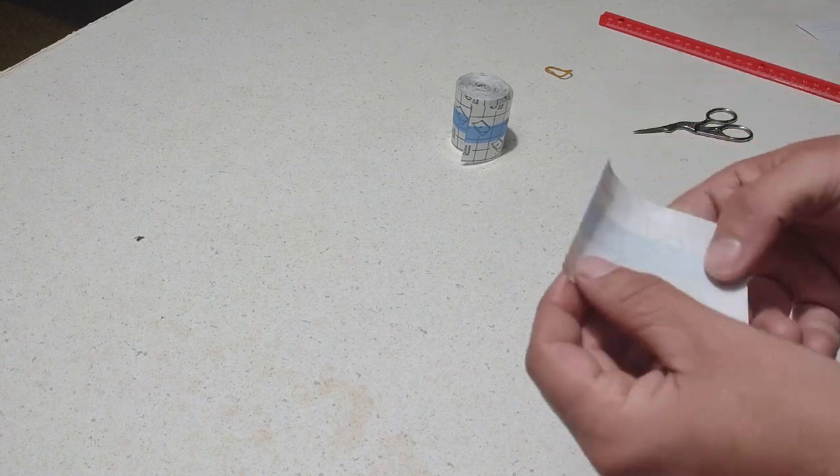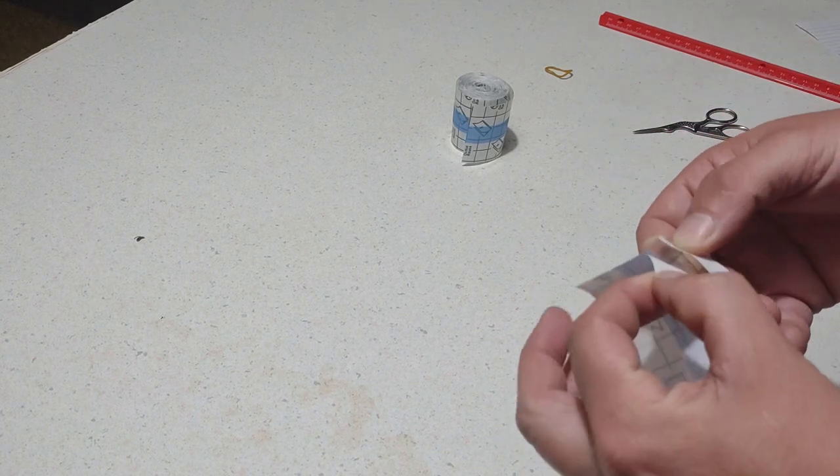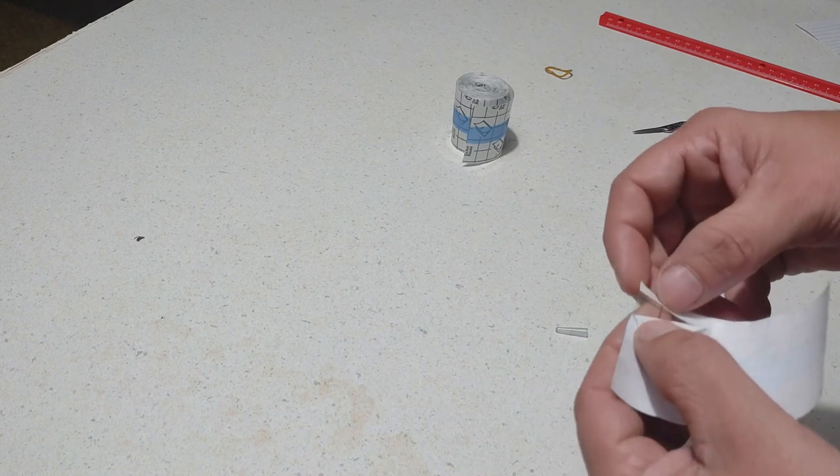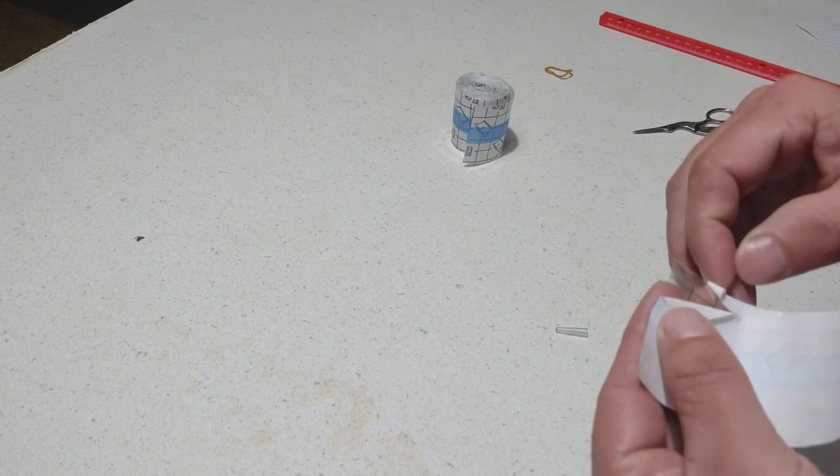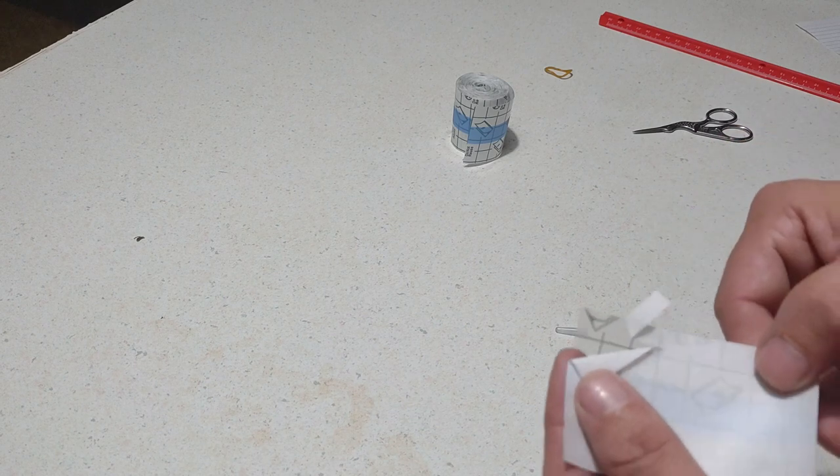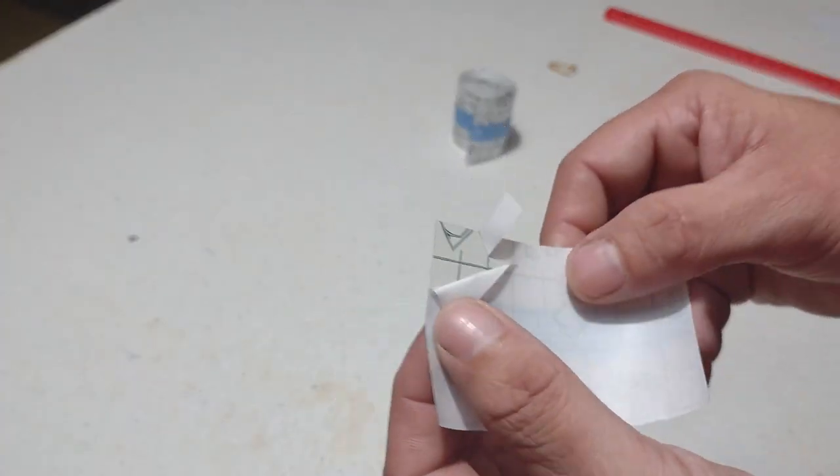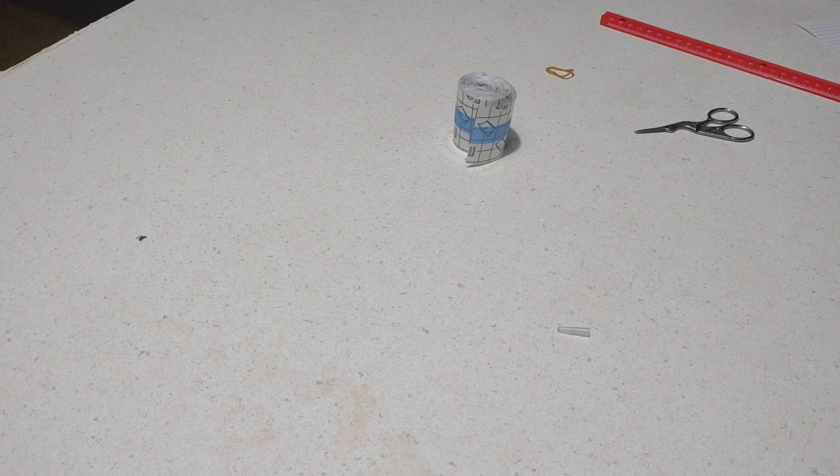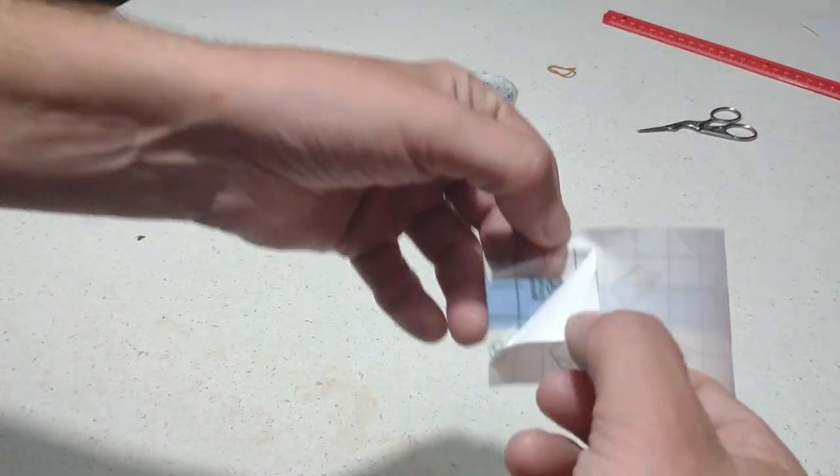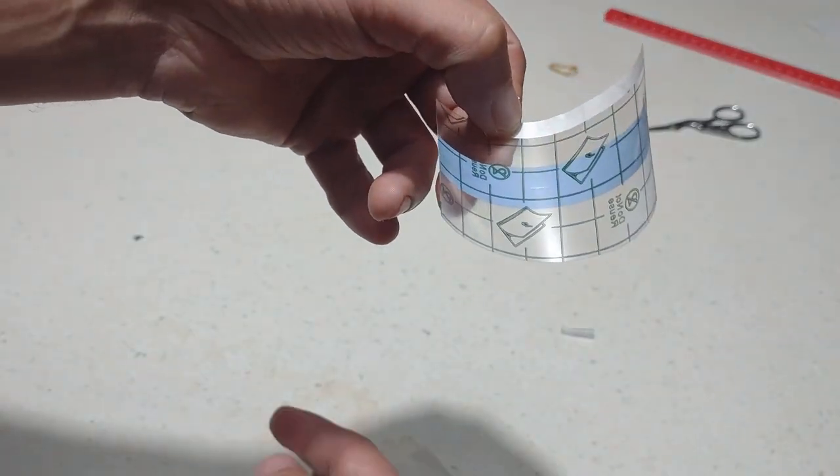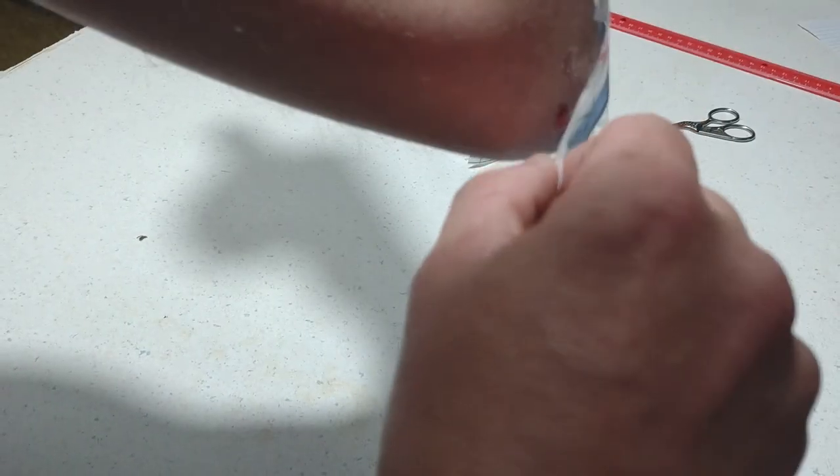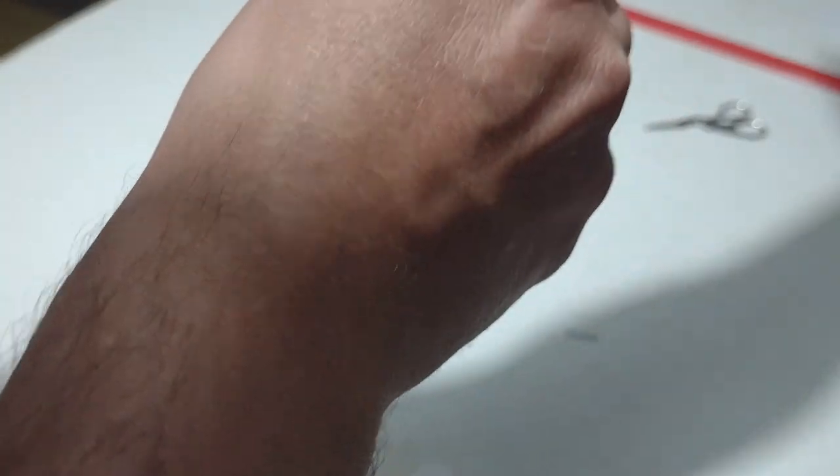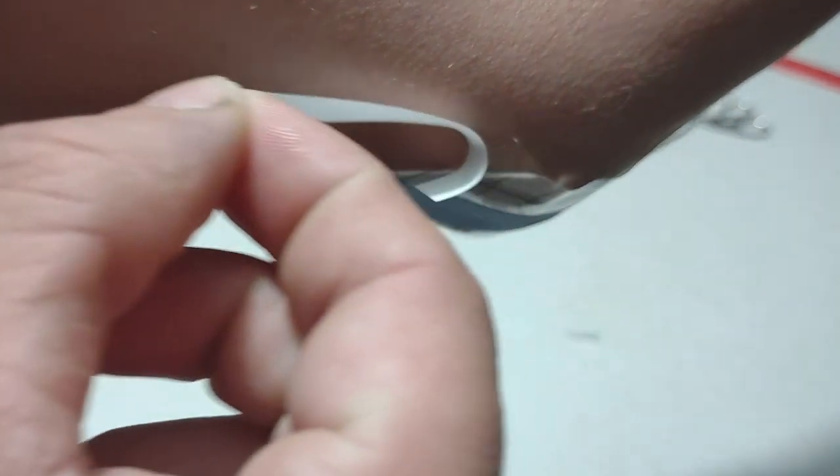This is how I like to apply it. Fold each one back like so. Pull off that, and then I don't know if you can see that but there is a wound there. So I'm just gonna cover it like this. Pull out the last bit of strip. Push it real good. Make sure it's sticking. And then peel off the blue.